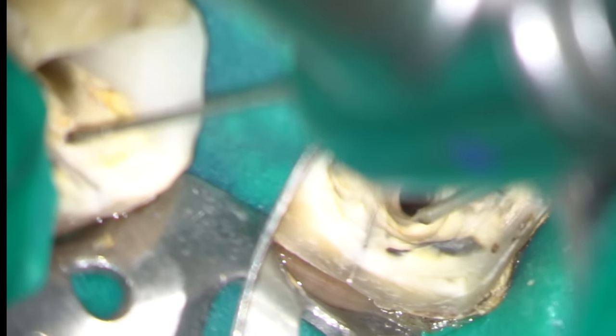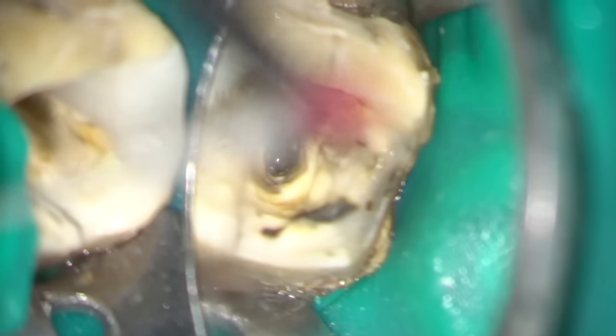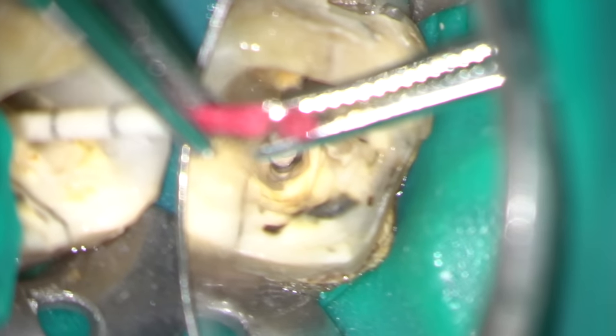Here I'm using a modified Gates Glidden burr to create a landing stage over the head of the piece of fractured instrument. Under high microscopic magnification, you can clearly see the head of the instrument that we need to retrieve, and I'm going to use my fine ultrasonic tip to the lateral aspect of the instrument to loosen it.